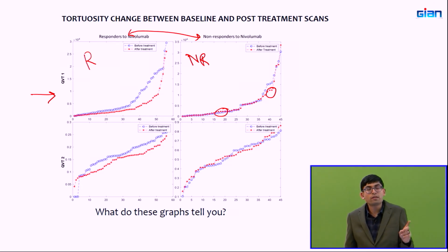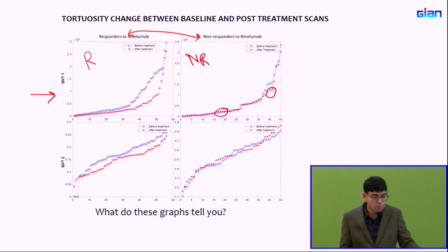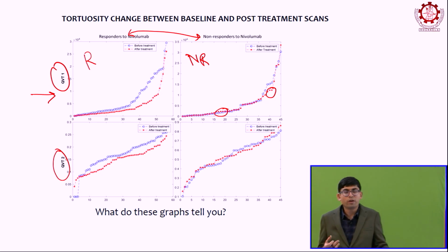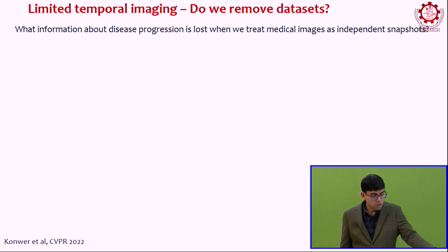And these are features that clinicians do not consider, but clearly if we use these subvisual biomarkers, these radiomic features, these tortuosity-based radiomics, we can provide the clinicians with some added information regarding the tortuosity of the vessels. QVT1 is one way of computing the tortuosity, it's one feature. QVT2 is another feature. So, you can have different ways in which you compute the tortuosity, right. These are just different ways of doing that. Okay.